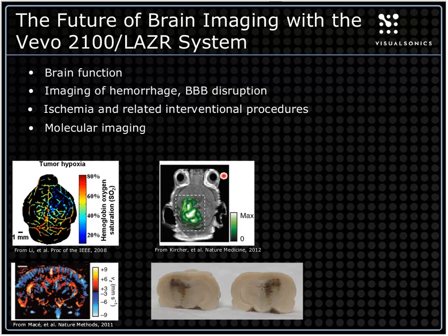So even if it's not very obvious on a regular ultrasound image, we can use different probes, carbon nanotubes in this case, in order to tag specific cells and do some real molecular imaging. And again, using spectral imaging or spectral unmixing to distinguish the different kinds of signal using different wavelengths with photoacoustics.